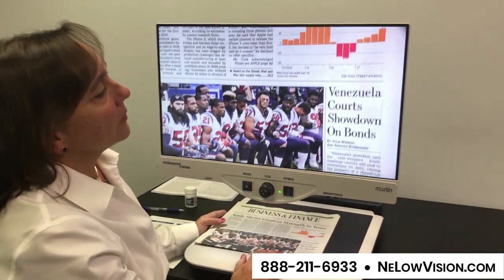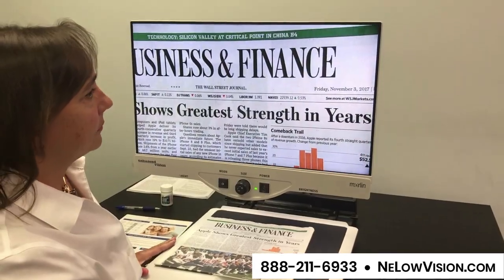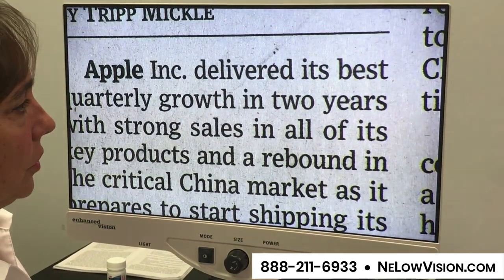I've got a newspaper here and it gives you a great overview of the whole paper. And then you can just go right ahead and zoom in to the magnification that's comfortable for you.